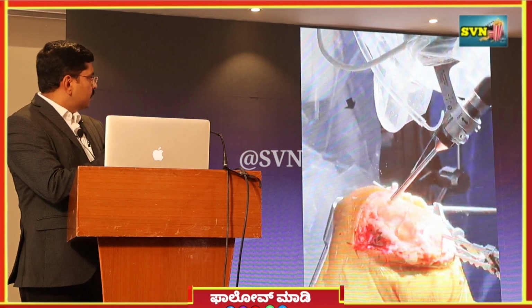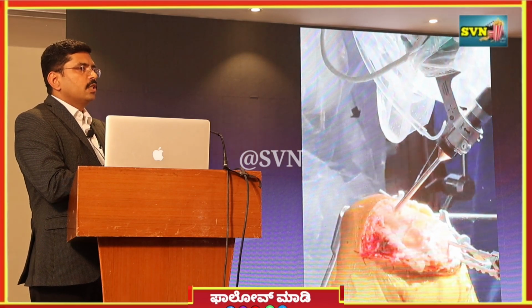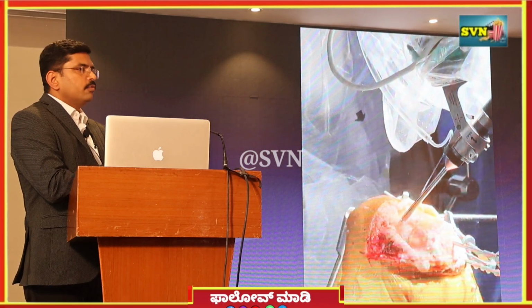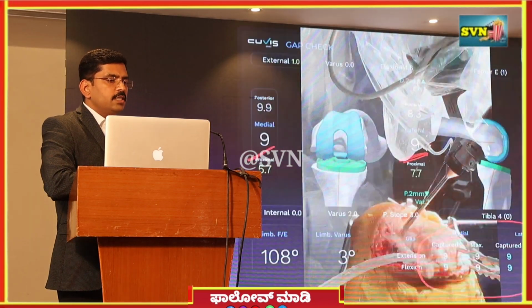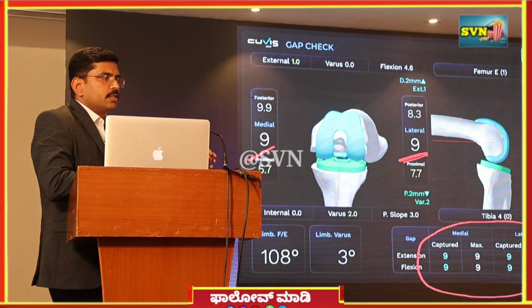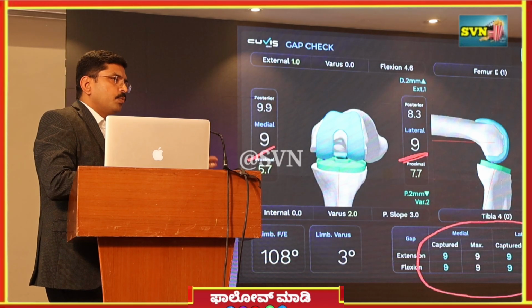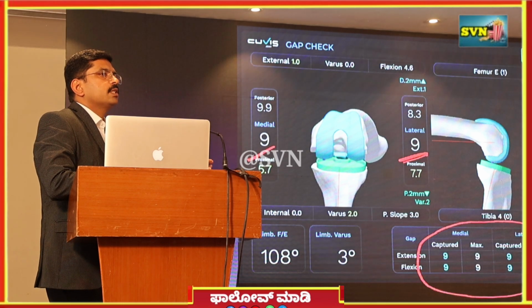In this surgery, there is a small drill which goes inside the bone and cuts it off. So that's why this can be performed with a small incision. Okay, so it is much more precise. For example, we can see on the screen the maximum tightness on the tissue that the computer has measured, and with the stress that we have measured, it is 100% matching.